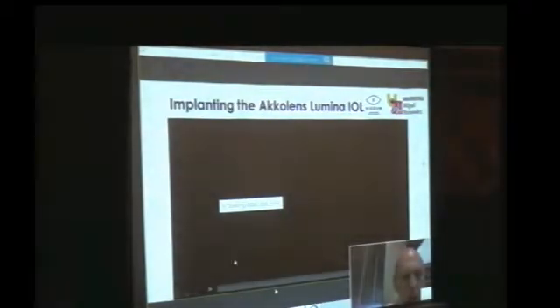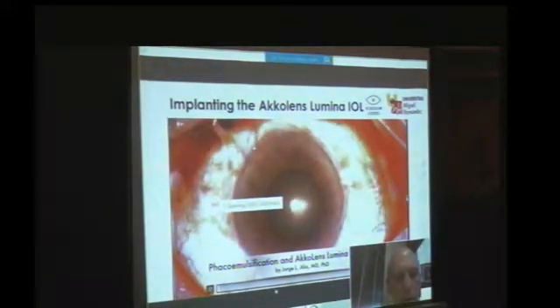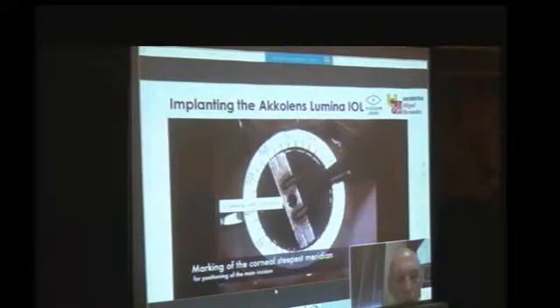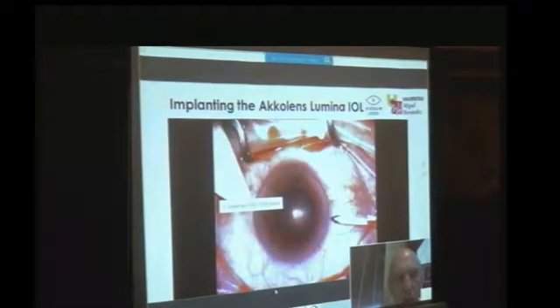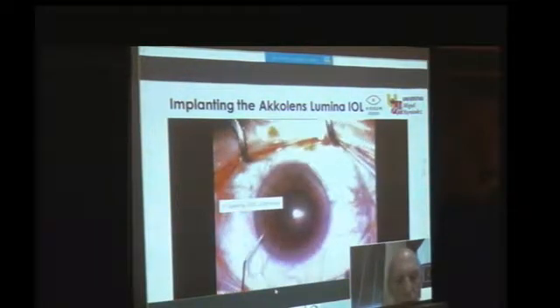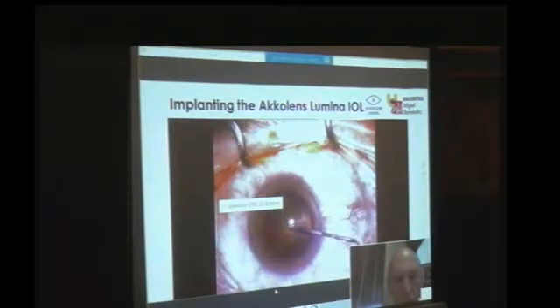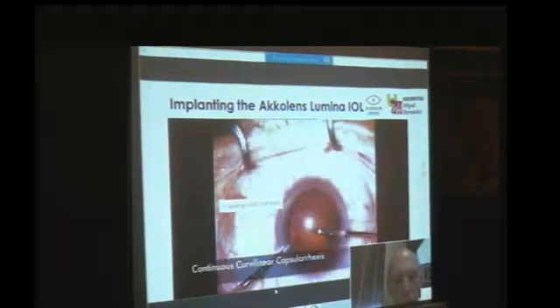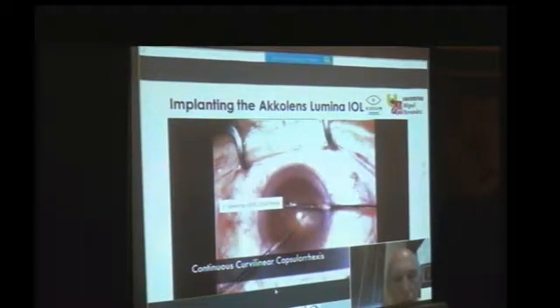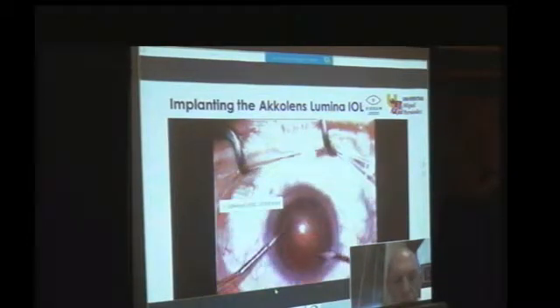This is how the lens is implanted, just for you to see how we perform surgery with this lens, which is implanted in the sulcus. The surgery is always performed making the main incision in the positive meridian. We use microincisional surgery, MICS, and we use intraocular mydriatics. We use at this moment Provis, and we create a capsulorhexis with a coaxial forceps, of a size that is our choice. Basically, I use a 5mm capsulorhexis.